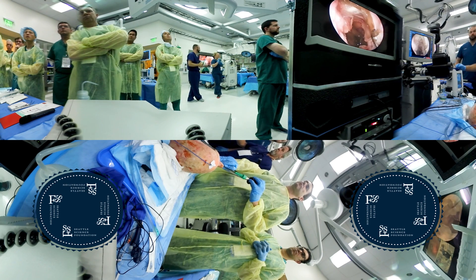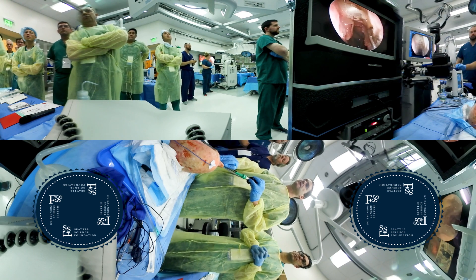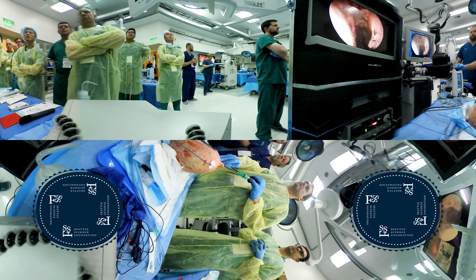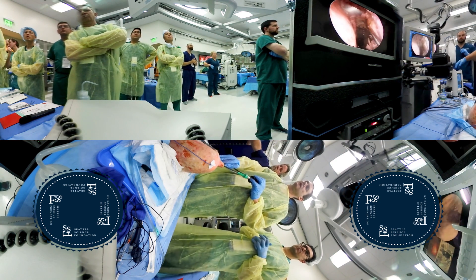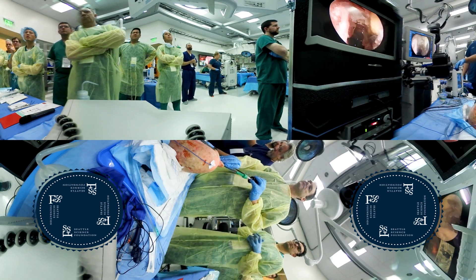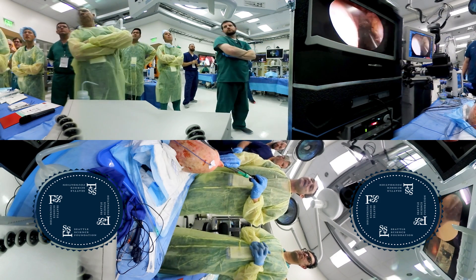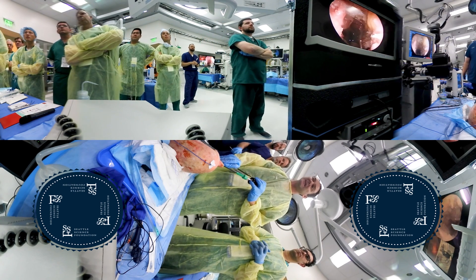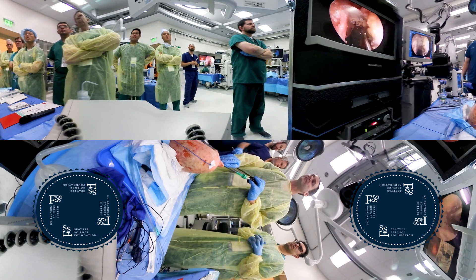This is for a medial orbit decompression. For the inferior orbit, you do the same thing but through the maxillary sinus. We're going to get all these pieces out. Ray has published the largest series of endoscopic DCRs and has also done a lot of orbit decompressions. I've never found a name for the tissue that covers the orbital fat — we've taken down the lamina, we've taken down the periorbit, but there's always this additional tissue.